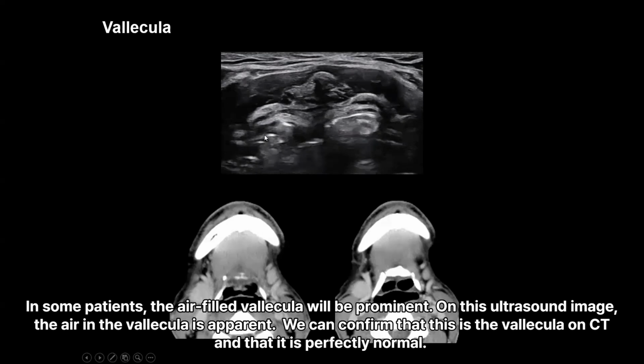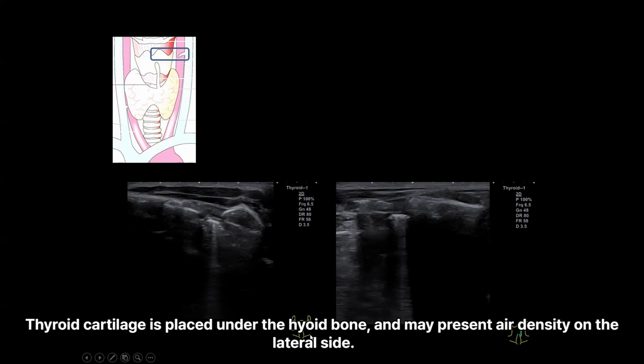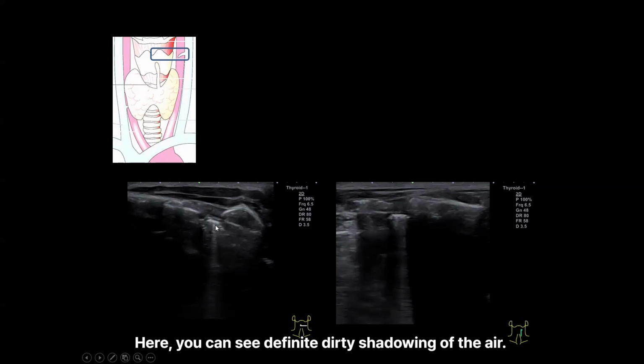In some patients, the air-filled vallecula will be prominent. On this ultrasound image, the air in the vallecula is apparent. We can confirm that this is the vallecula on CT and that it is perfectly normal. Thyroid cartilage is placed under the hyoid bone, and may present air density on the lateral side. Here, you can see definite dirty shadowing of the air.